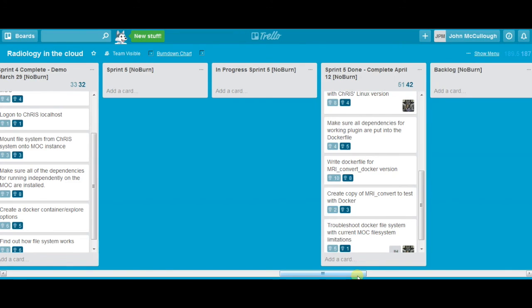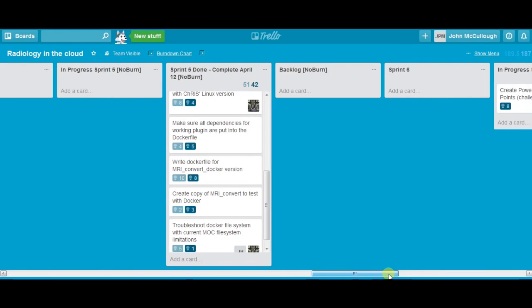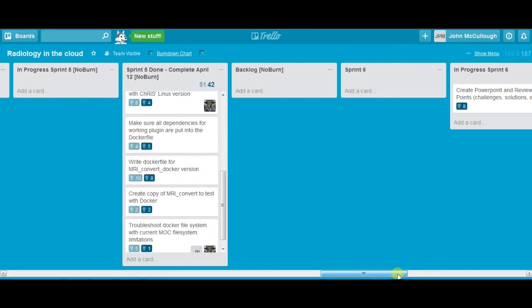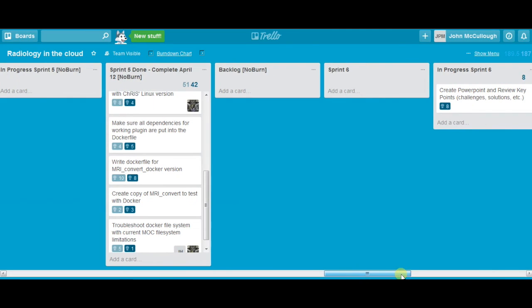At the end of this sprint, all that was left to do was create the glue that held the front and back end together and allowed them to talk. During the last sprint, we spent a lot of time debugging the front end issues, and figuring out how to spawn a Docker file from the local host instance.